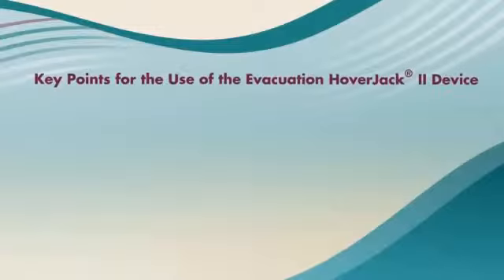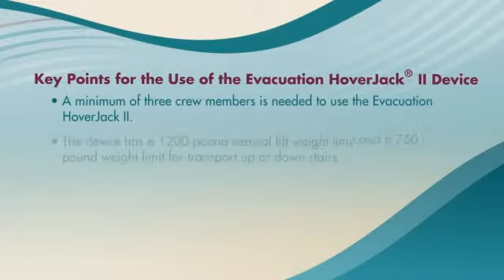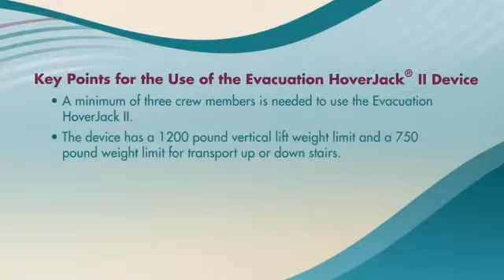We instructed on the use of the Evacuation HoverJack 2 as a transport, lift, and stairwell evacuation device. Here are the key points from this section. A minimum of 3 crew members is needed to use the Evacuation HoverJack 2. The device has a 1,200-pound vertical lift weight limit and a 750-pound weight limit for transport up or downstairs.